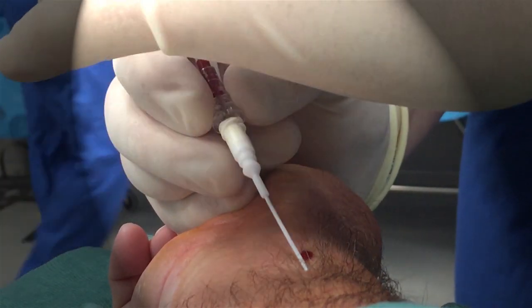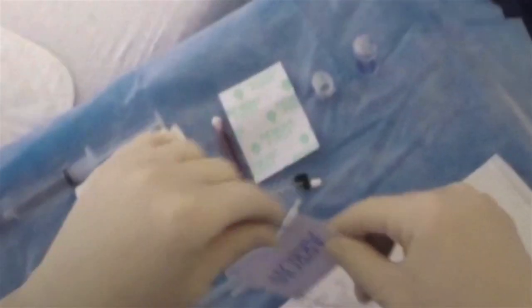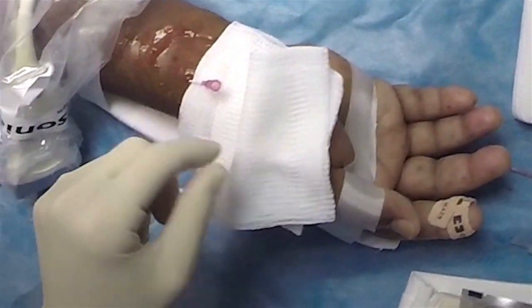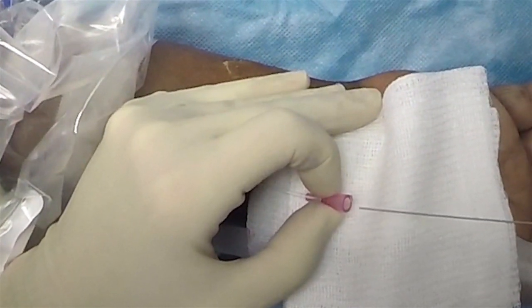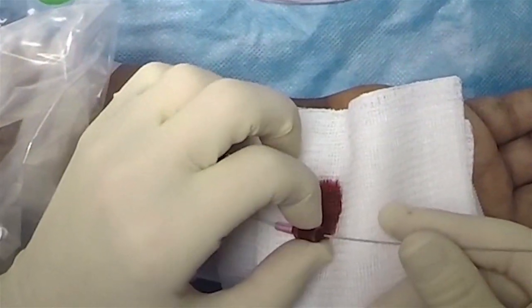Finally, if you are unable to thread the wire after multiple attempts, one common trick is to push the entire apparatus into the skin. The introducer will serve to push the catheter through the anterior and posterior wall of the artery — this is called the through-and-through method. You will need a separate straight guide wire for this technique. Since the catheter is through and through the artery, slowly retracting the catheter should yield a situation in which the tip of the catheter has just passed through the far wall while still remaining inside the lumen. Slow retraction until pulsatile blood flow is seen is key. Slow dripping blood without pulsatile flow usually indicates failure of this technique.